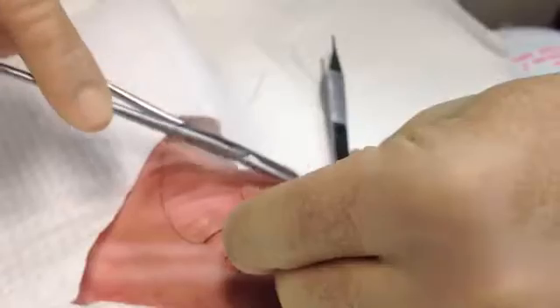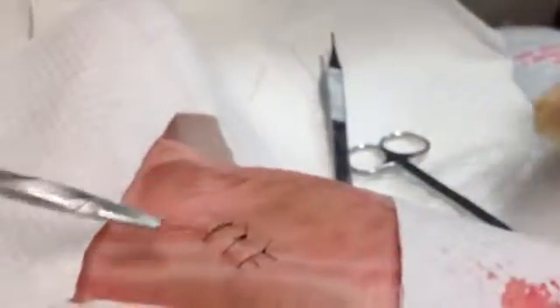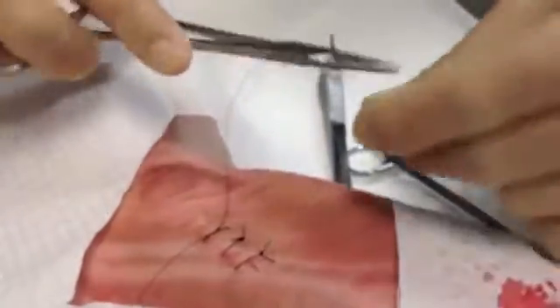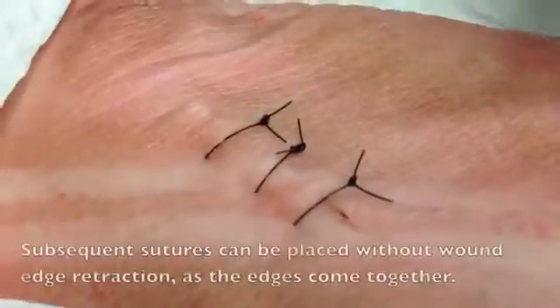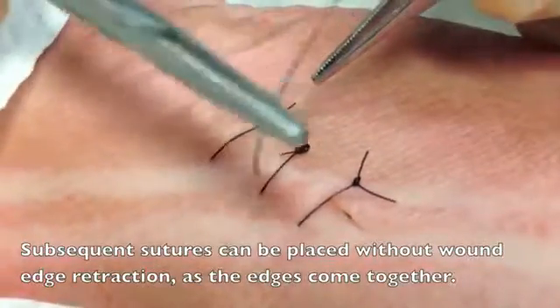So as you see, I'm grasping the far end of the suture, kind of closer to the needle edge, and I'm tying farther away from the wound edges. By doing this, you prevent pulling up accidentally on the knot and loosening your knot.